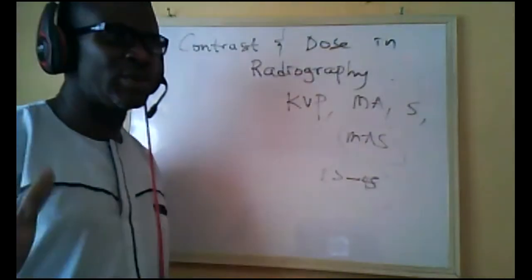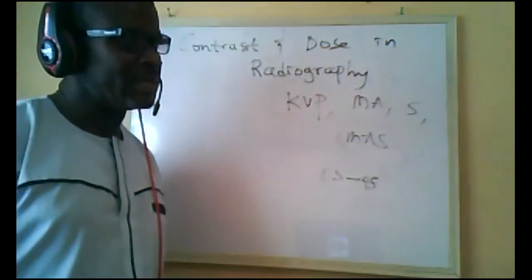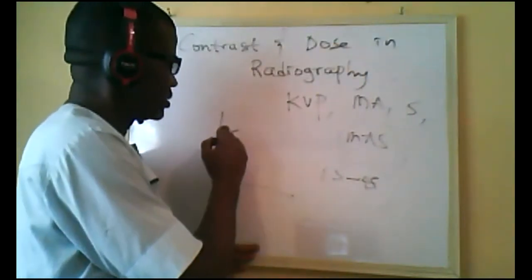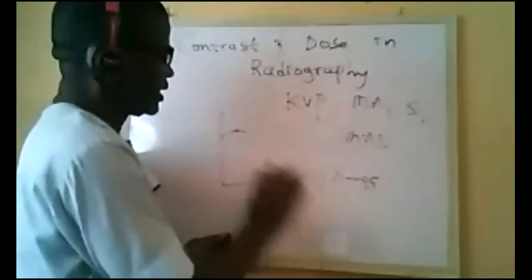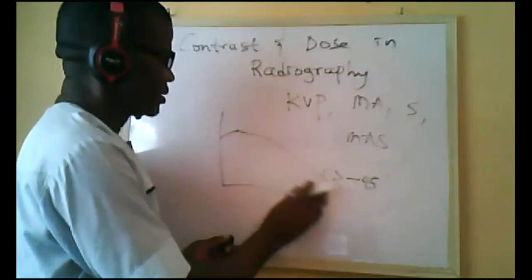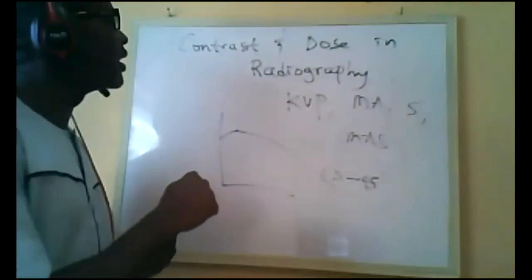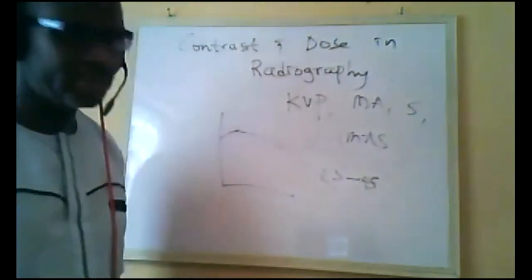It is not very linear. At some point in time, the graph will do something, most likely going down again. There is a relationship between the MAS and the KVP and those. All these values contribute.